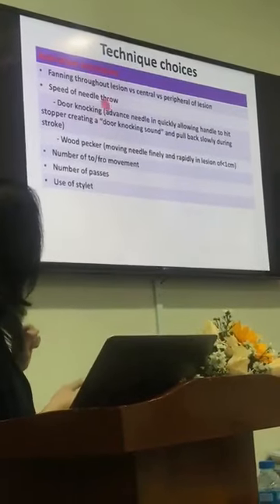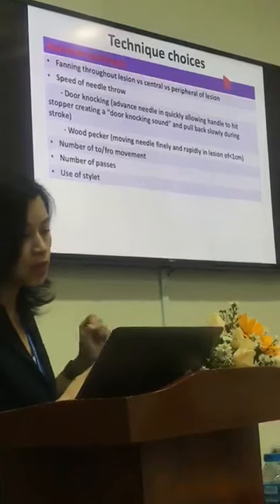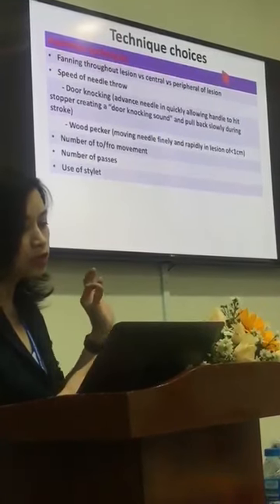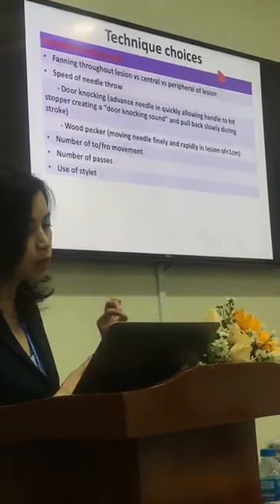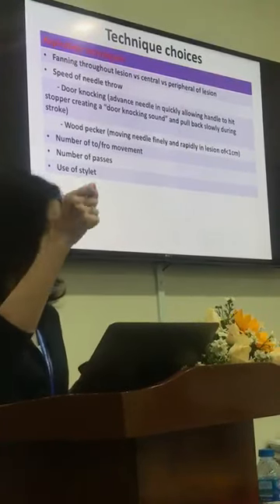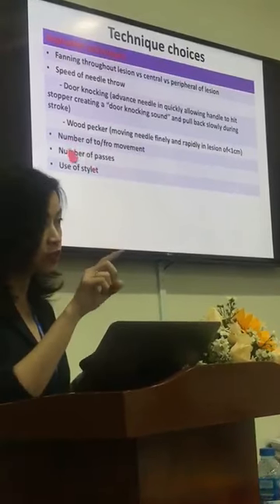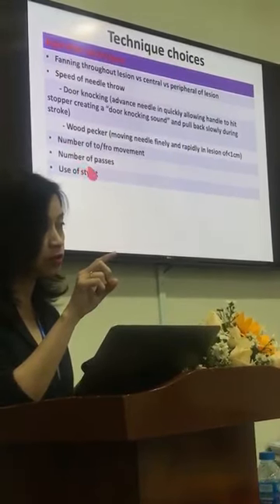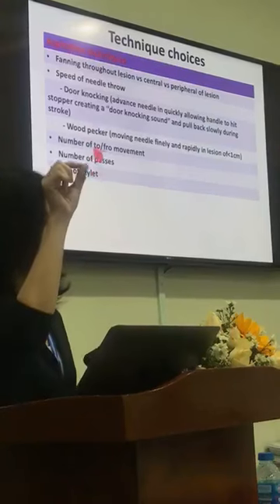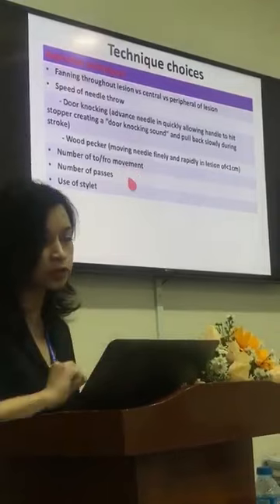The woodpecker technique is good for a small lesion, like a lesion less than 1 centimeter. Basically, you're moving the needle finely in and out rapidly within the lesion, sort of like quick jabbing in and out like that, okay? But because the lesion is very small, sometimes you can't do a long stroke. You can only do fine and small strokes.